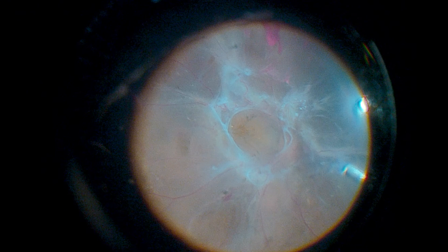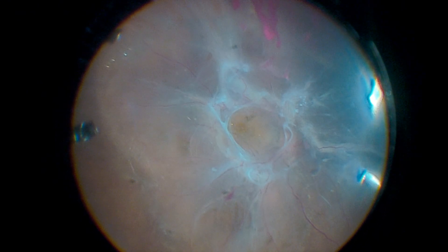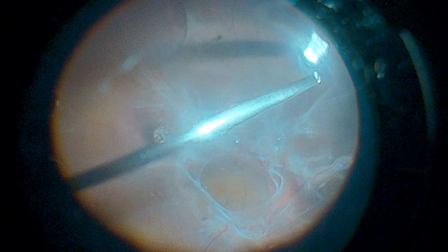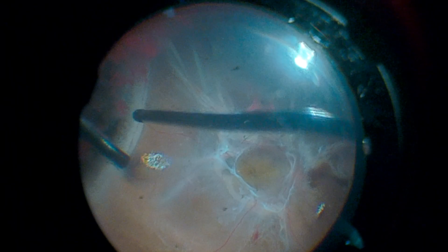This is the case of a patient with tractional retinal detachment due to proliferative diabetic retinopathy, for which surgical treatment with vitrectomy was indicated. We can observe a total retinal detachment with multiple areas of traction at the posterior pole due to fibrovascular proliferation.